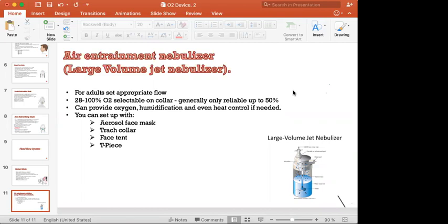If the air or the volume inside the pleural cavity is replaced with 100% oxygen, after a while the oxygen will be absorbed through the patient's tissue, and the pneumothorax will resolve.